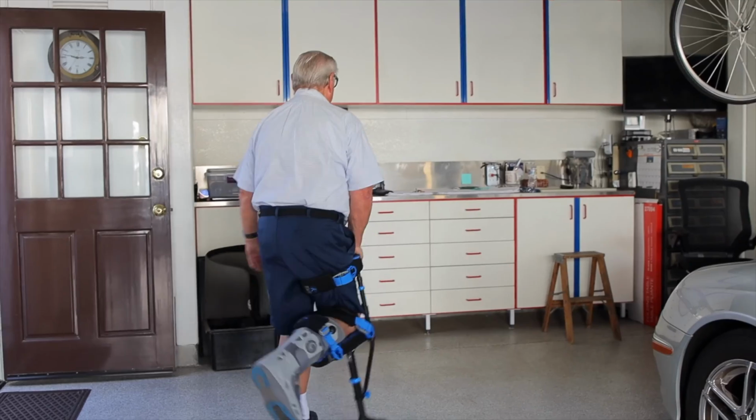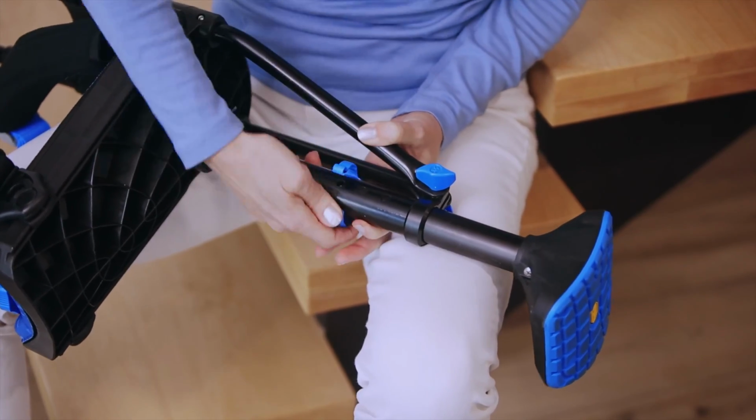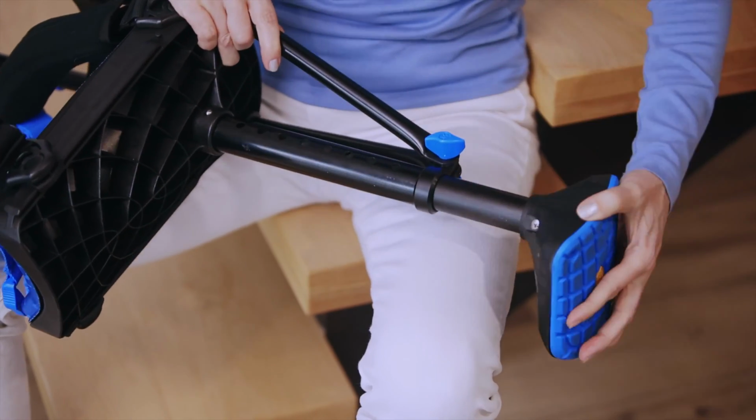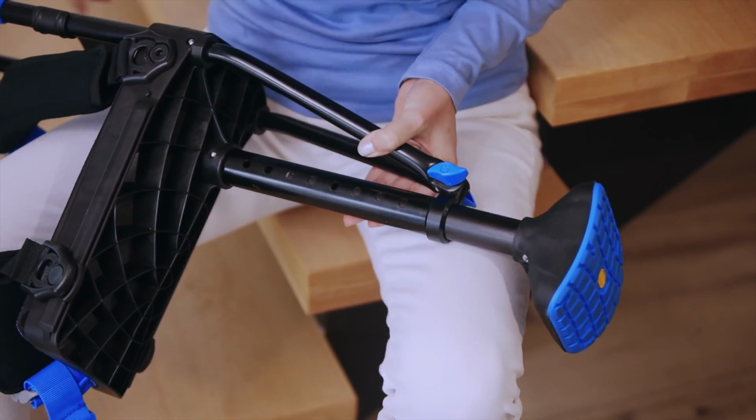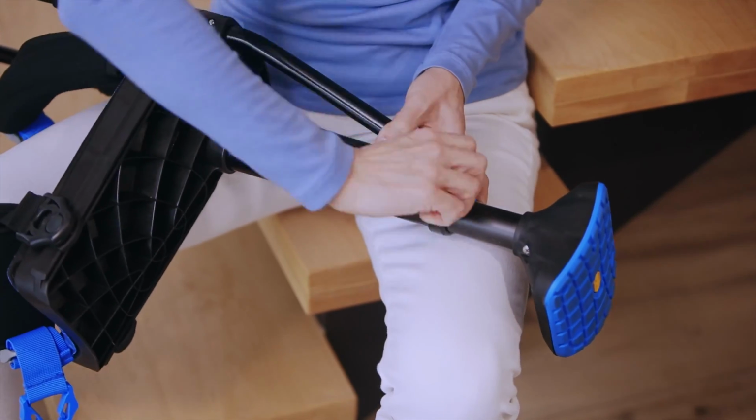Most patients adapt quicker if the iWALK leg is slightly shorter than their good leg. Before you start, adjust the lower leg height adjustment down by 1 setting. After the patient has basic proficiency on the crutch, you will restore the equal leg length setting.